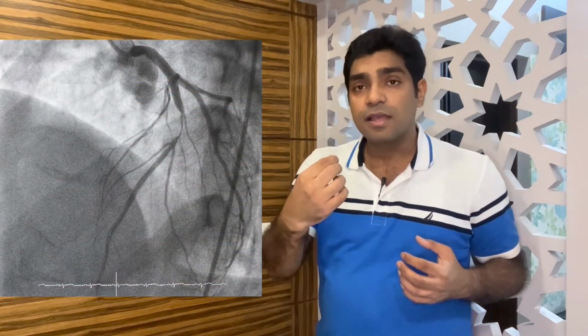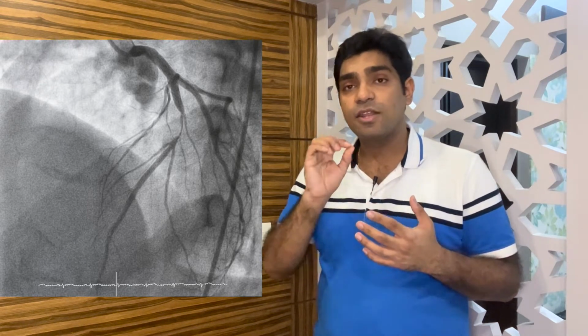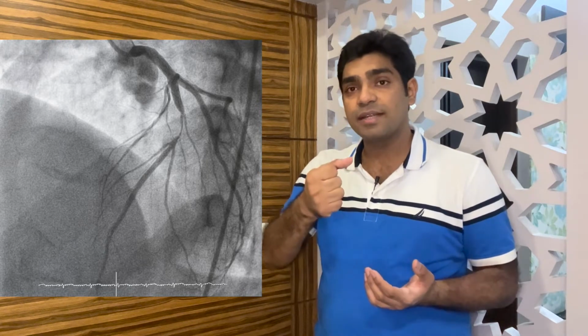Now there is something called a high resolution CT scan or contrast based CT scan, or a CT angiogram you might have heard of, in which the blood vessels supplying blood to the heart are detected. So how does that happen? A radio opaque dye, a radio opaque chemical, is injected into your blood, meaning it absorbs the radiation, and then your heart is viewed through it.